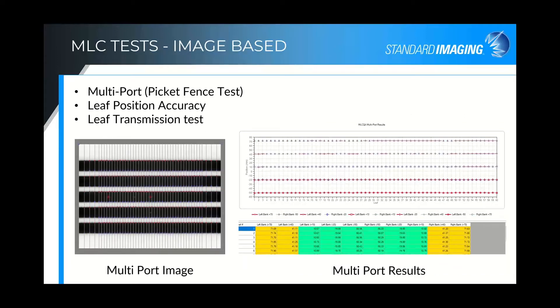For MLC image-based tests, we have the multi-port picket fence test, leaf position accuracy, and leaf transmission. You can use a specific phantom or simply use your graticule tray — giving you phantom-less tests for this group. Results show the leaf edge positions for different banks at different positions — left 70mm, 40mm, and so on across the right and left banks.